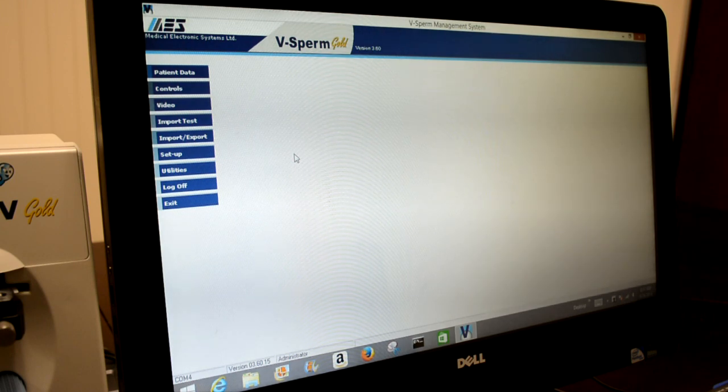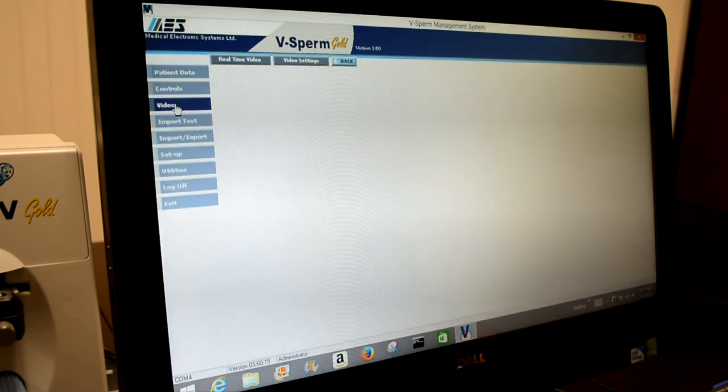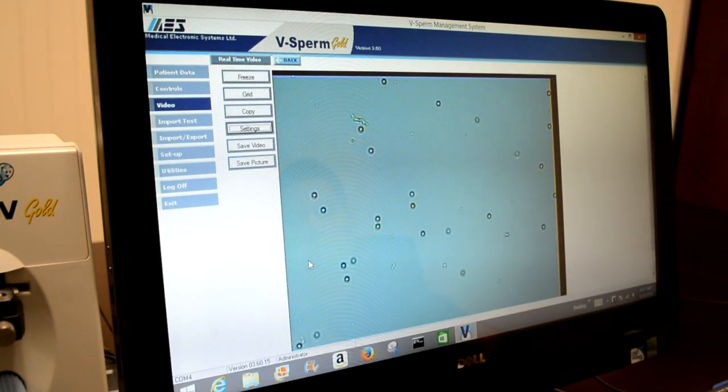If you want to count your sample using the visualization system, an easy way to do so is by opening the video tab in vSperm. This will give you a nice large field of view. We'll click on real-time video, and the image will be displayed.